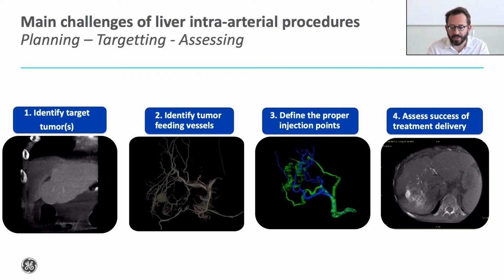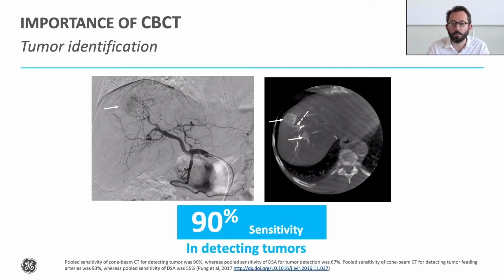And as a general consideration, one of the main technological improvements and innovations that we have seen over the past, say, 15 years is the introduction of cone beam CT technology. And it has helped us improve for all these steps.